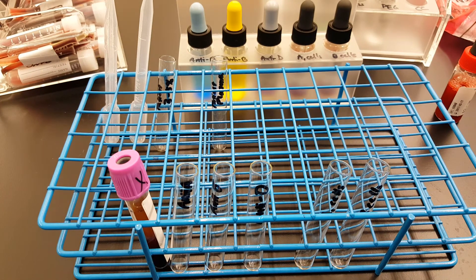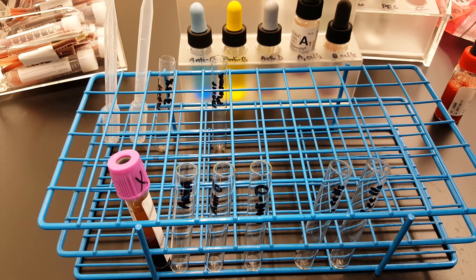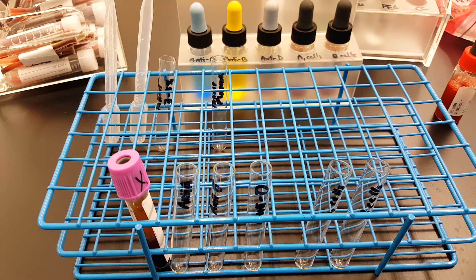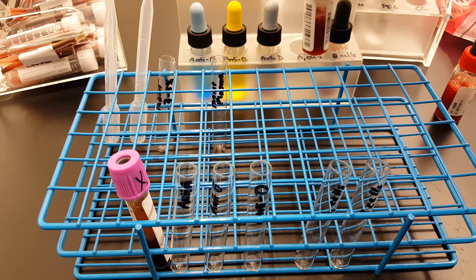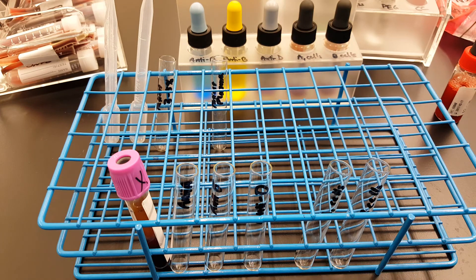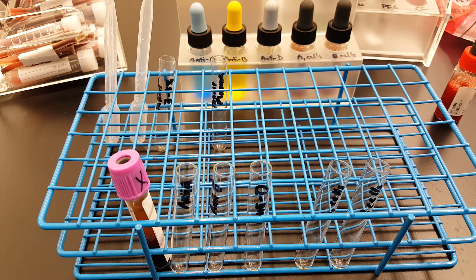Now when we talk about the reverse typing, we're talking about looking at reagent cells and how they react to the patient's plasma, or the liquid portion of the blood. So we're testing reagent red cells against the antibodies that are in the patient's plasma. If there is a reaction there, it's confirming the reaction that was in the forward typing.